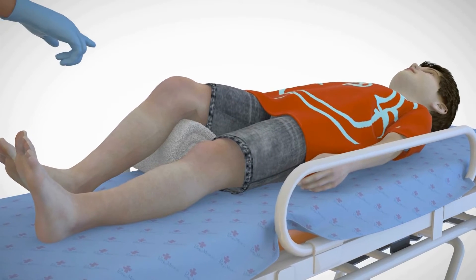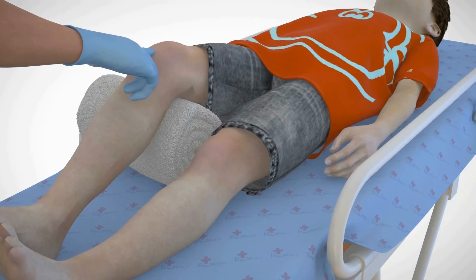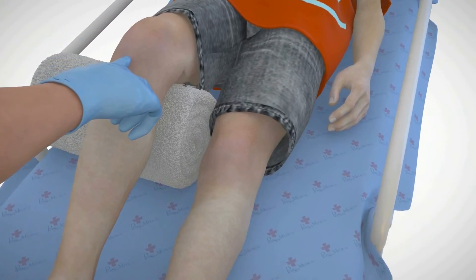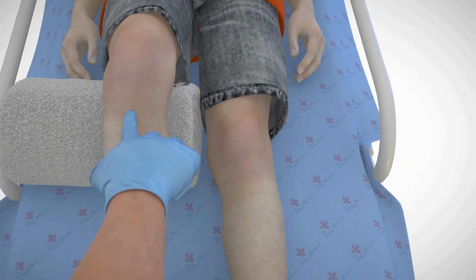Finding the correct I.O. location in pediatric patients can be a challenge. The NeoP location arrows offer an innovative solution to this challenge by ensuring that the provider locates the correct tibial access point.